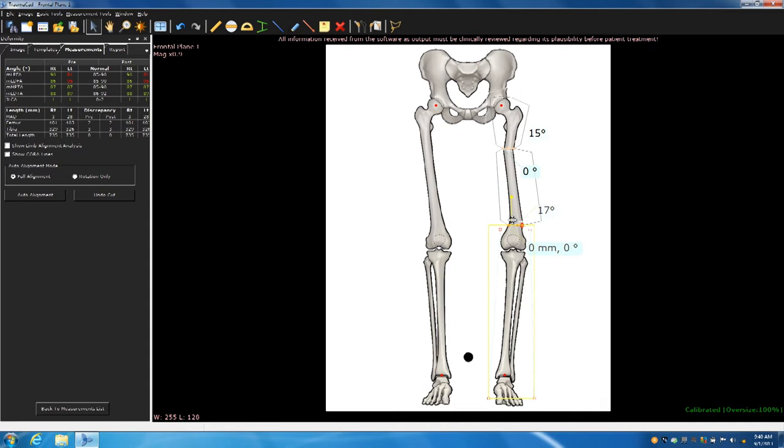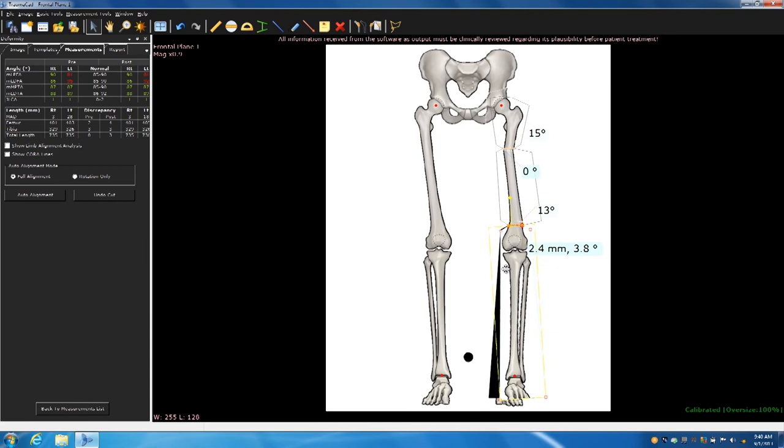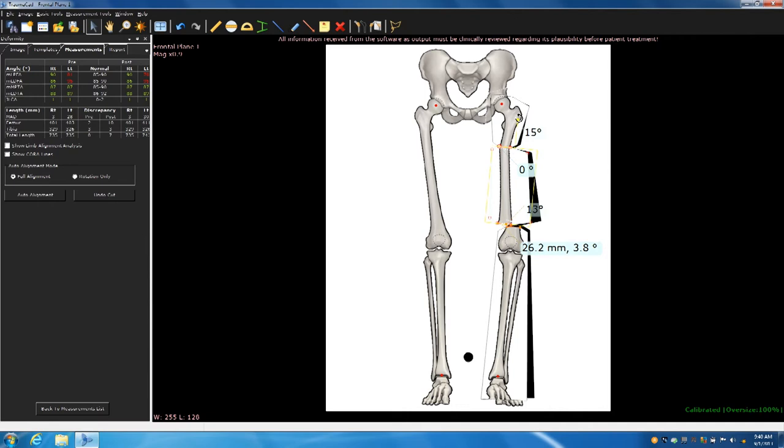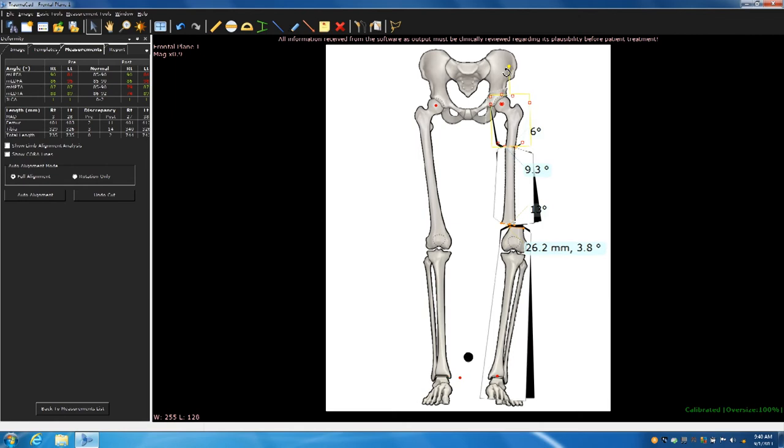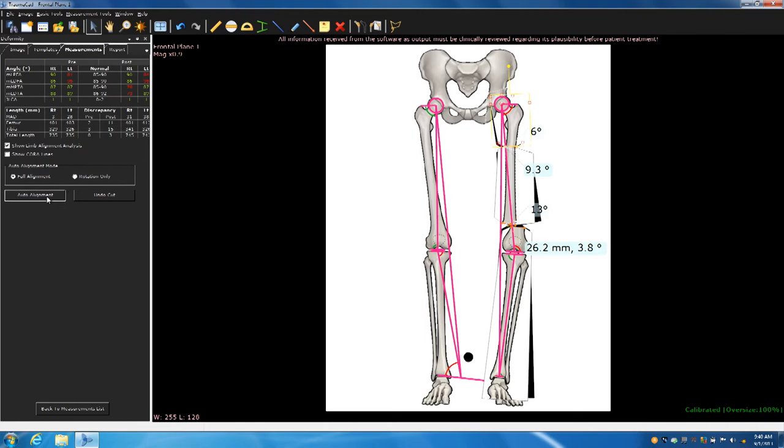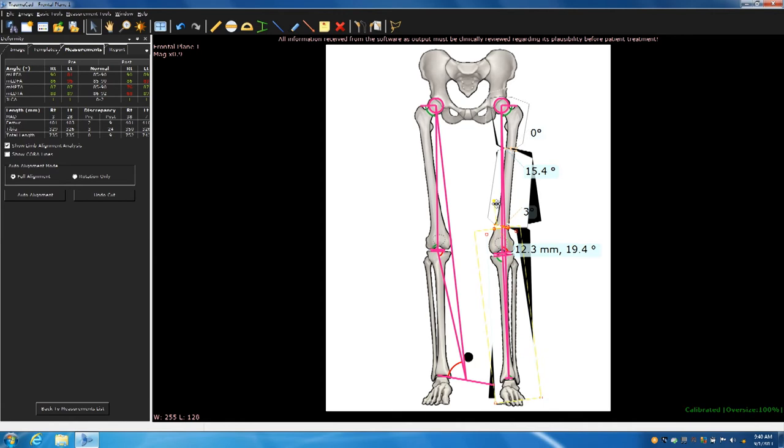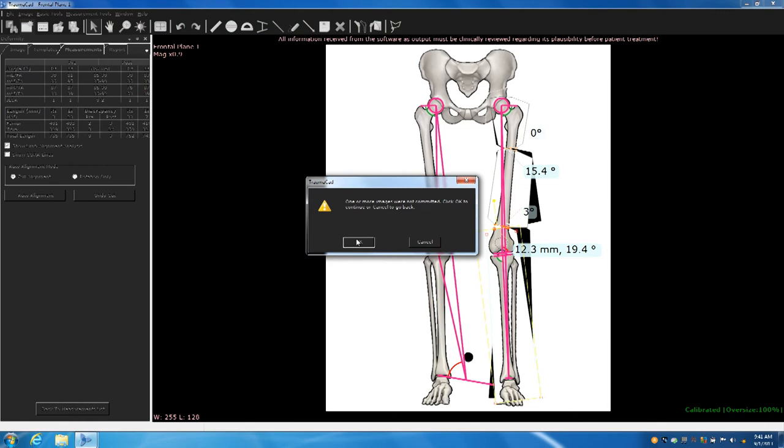You can scan over that and it gives you all your angles. And you can say, I like that. Now, if you're like me and you like to be in ultimate control, you want to undo your cut. It goes back. Hide your lines. And finish and cut without your CORA lines. And you can grab each individual segment by this little yellow tool. This is your joystick. And you can rotate. You can make the person dance. You can do whatever you want to do. You can shift. You can shift this one. You can make them stand up straight. You can do all of these things and decide how did you do just by eyeballing it. Hit your limb alignment again and it gives you your analysis. So you're still not there. So you can adjust this as you want to. You can have the computer adjust it. Sometimes you might say auto alignment because you did it wrong. And then you can grab this again. You can grab the segments after you've auto aligned. And you might want a little bit more valgus because they might have medial compartment OA. You might want a little varus for whatever reason, if they have a very large thigh, things like that. And that's how powerful this can be. So let's go. Everybody correct the bone.